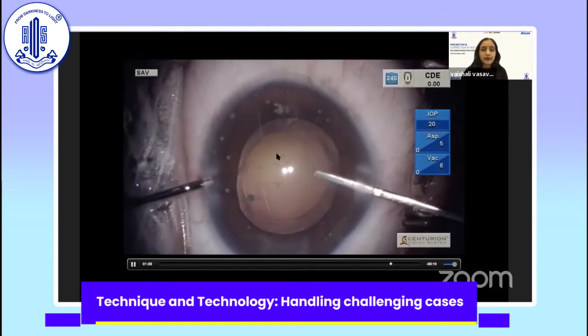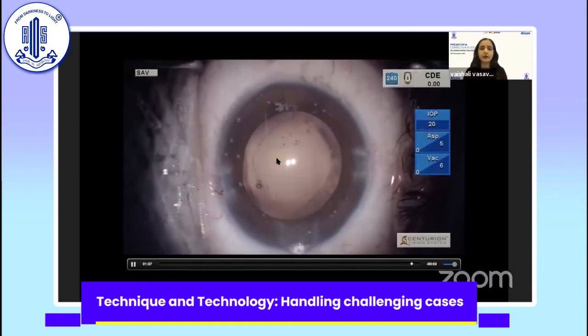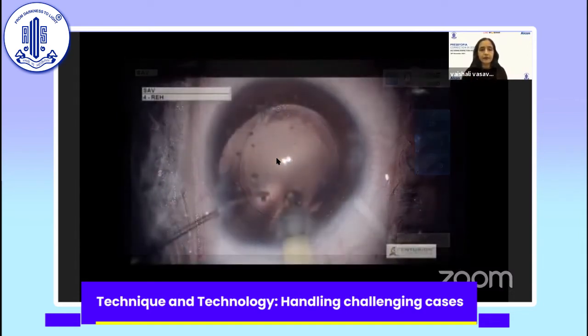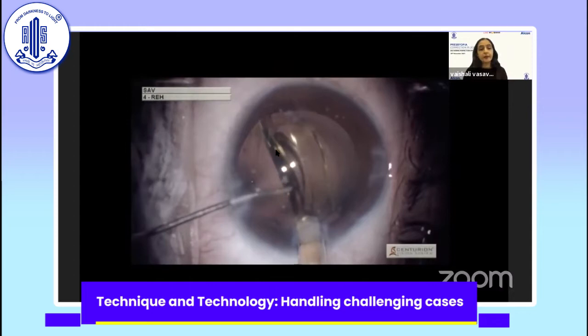So as you can see now, this margin is very strong and continuous. So now I'm not worried about putting in any IOL in the bag. We are not talking about sulcus implantation. Again, inflate the bag here. And you implant in the bag very slowly. Now, one practical tip here, that sometimes if you use an IOL system which is very tight incision, you might want to enlarge the incision, at least internally a shade, because you don't want a forceful implantation.